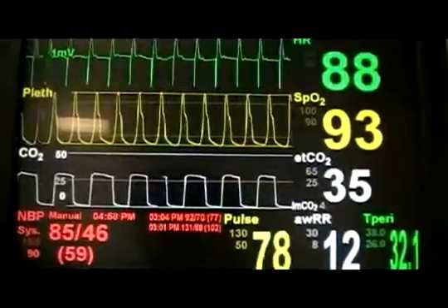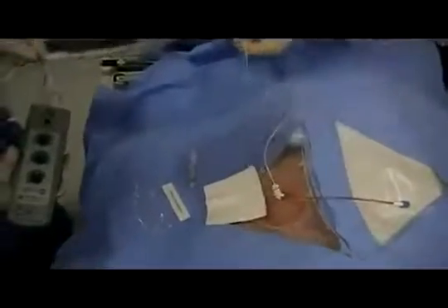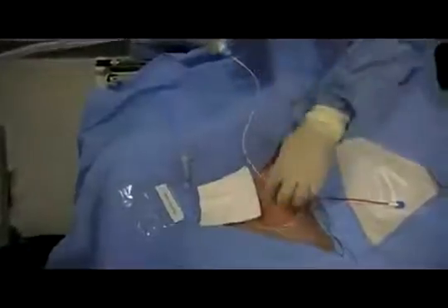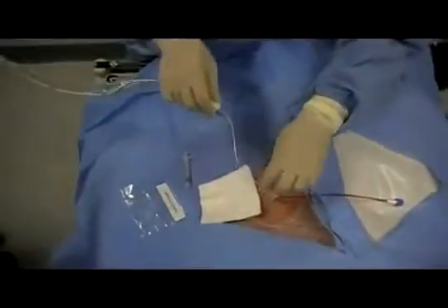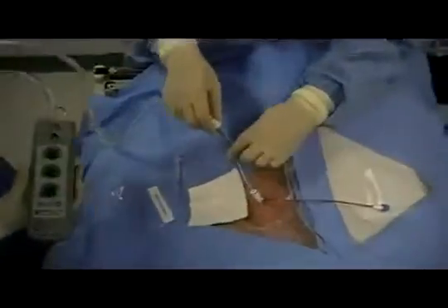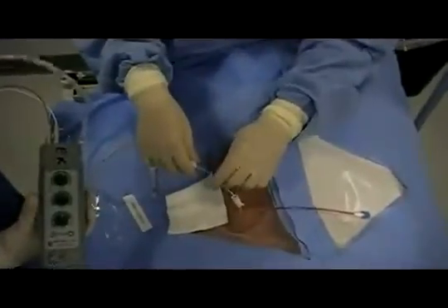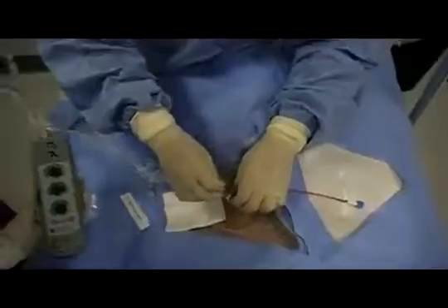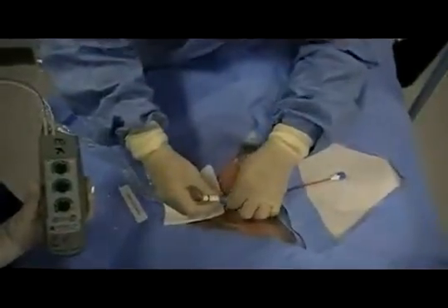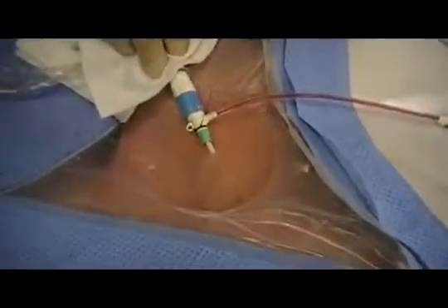Once capture is sustained on the monitor, the contamination shield can be connected to the cordis port and the cordis secured. It is important to remember that at any time, an air embolism can be introduced through an unsecured catheter — all precautions should be taken to prevent this occurrence. The sheath should connect securely to the cordis catheter, and the entire line should be secured using 3-0 silk on a straight needle. As always, a sterile barrier is applied to reduce the incidence of infection.